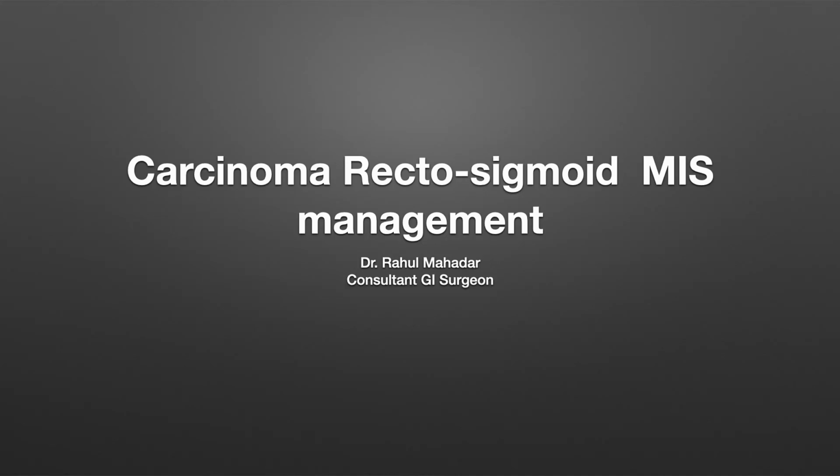Hello friends, today we are going to talk about a case of carcinoma rectosigmoid, minimal invasive surgery management.